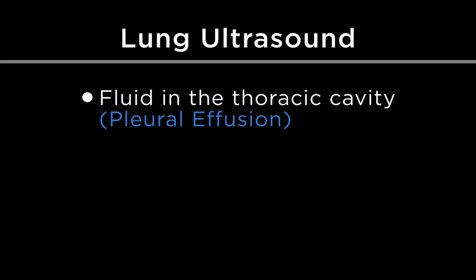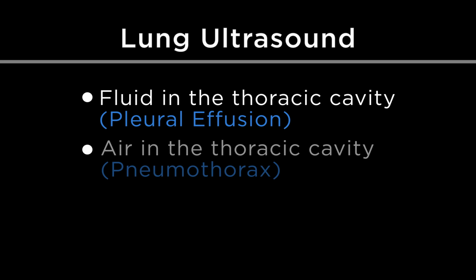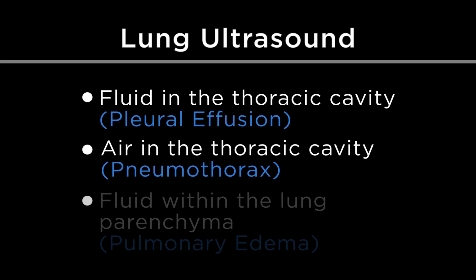In this introduction to lung ultrasound, we will demonstrate how to answer the clinical questions of whether or not there is fluid in the thoracic cavity, air in the thoracic cavity, or fluid within the lung parenchyma.